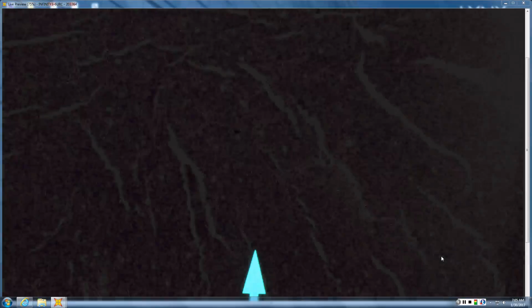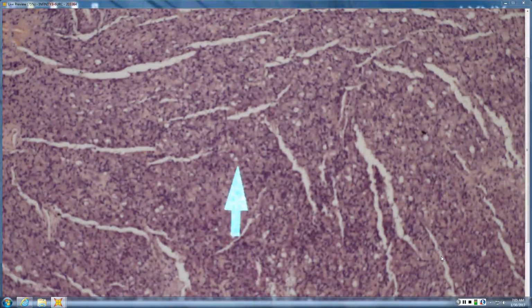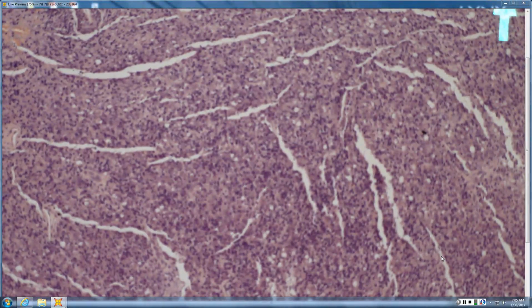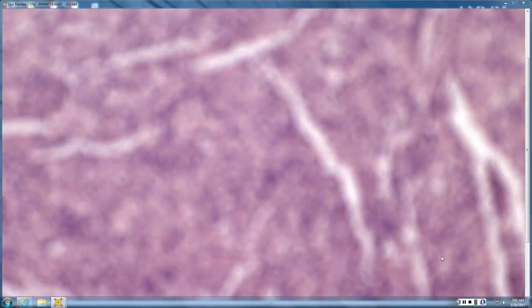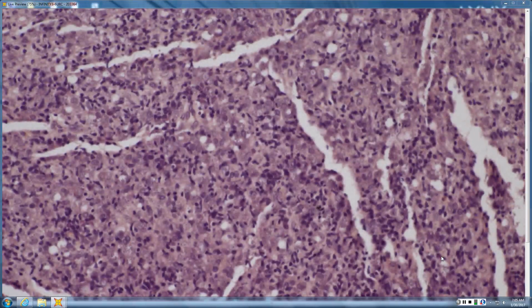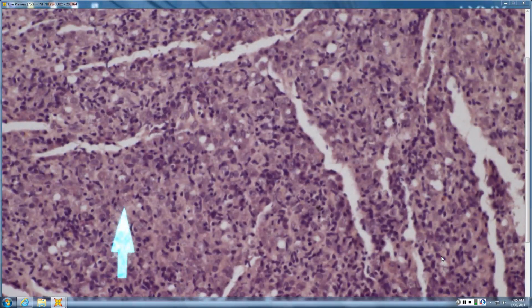And then as you get in closer, you still might be thinking that. As with any bug hunt, you have to get down on your hands and knees, so to speak. But in this case, from this altitude, you can start to see that there are granulomas forming. There are probably some giant cells in here, but this whole slide speaks of something infectious, particularly with all these little vacuoles. So you want to get down and investigate that. And now, at this magnification, you can start to make out all these little tiny organisms.